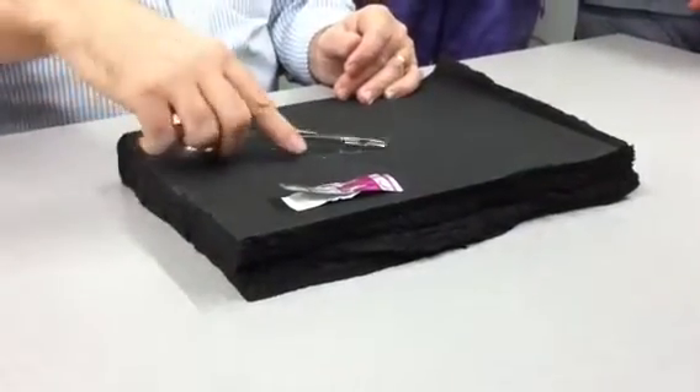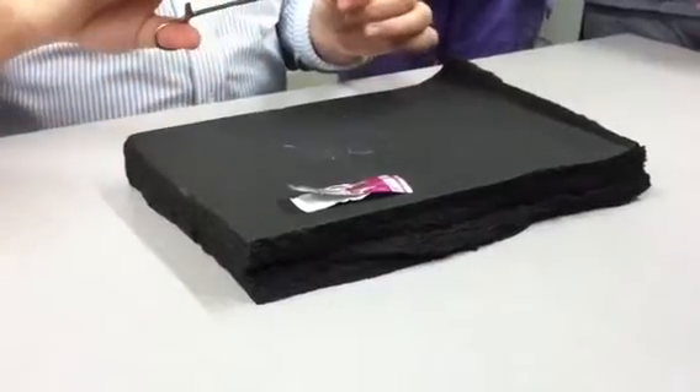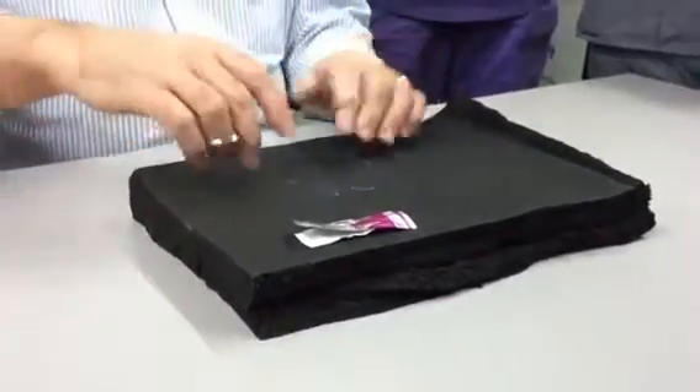Incision. I'm going to make the bite towards me, curl that out, and gather it. I'm going to do the exact same thing on the next one without tying a knot.